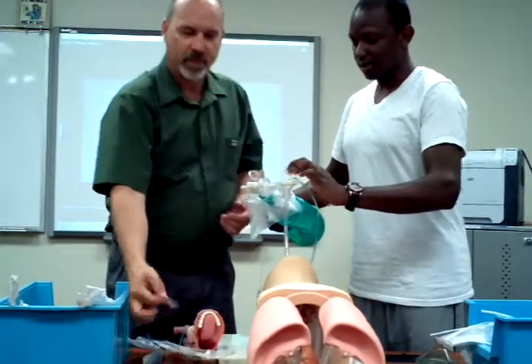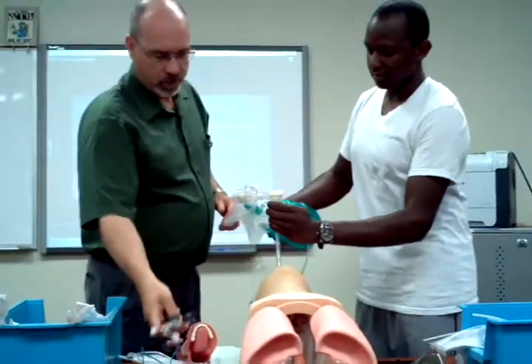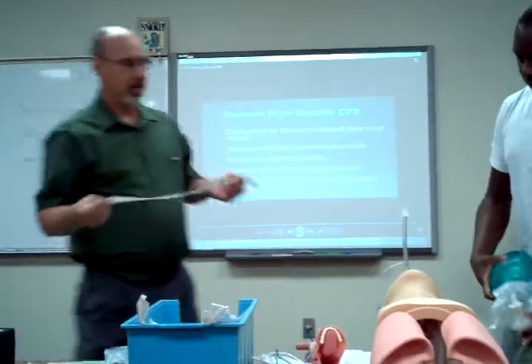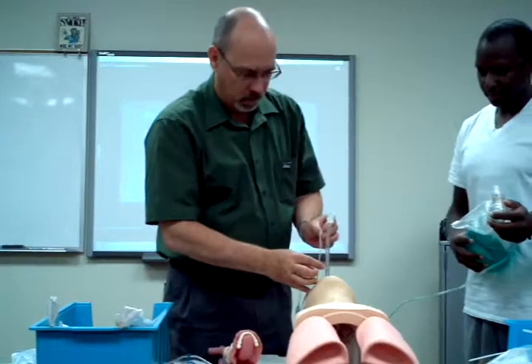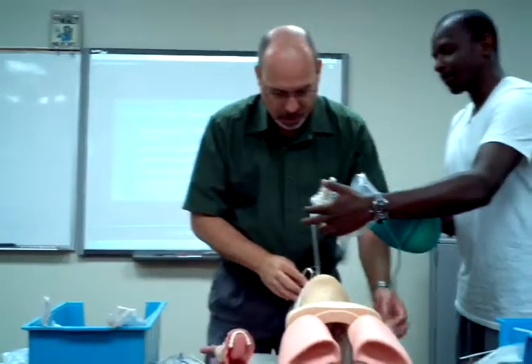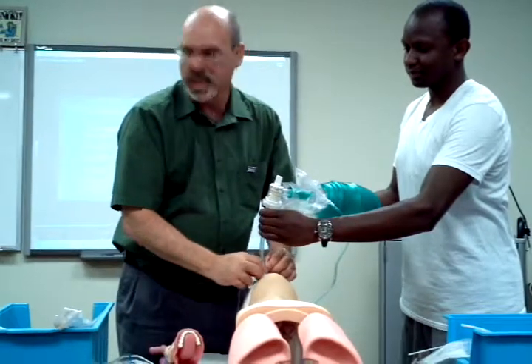So how are we going to check? X-ray, chest excursion. And then x-ray to make sure that we're in the right spot. So then we've got the tape ready to go. Would you continue to bag while you're taping it up? Robert needs to be bagging. And we're just intubating here — this isn't CPR.